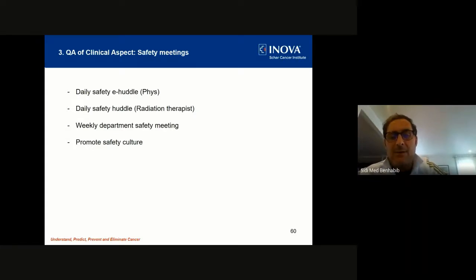Every morning, the physicist of the day sends an electronic huddle. This electronic huddle is basically just an email to the entire department saying that today we're going to treat 30 patients on TrueBeam 1. We have the BID case, or we have an SRS case, or special cases. So everybody in the department will know what's going to happen on that specific date. And I think everybody in the department likes this email in the morning.